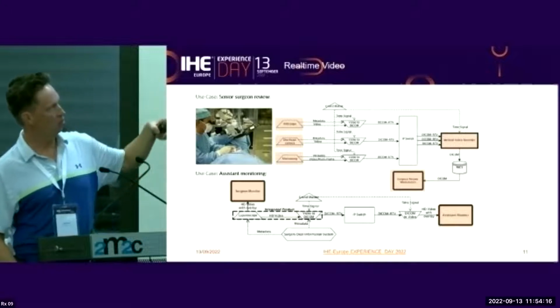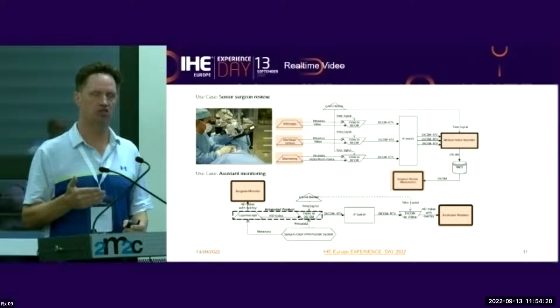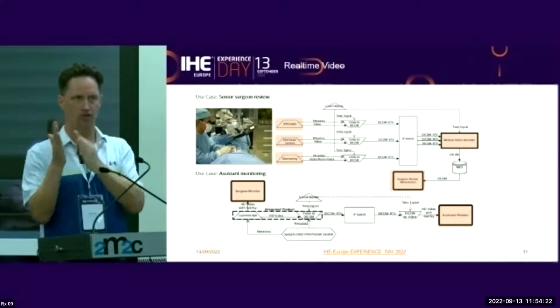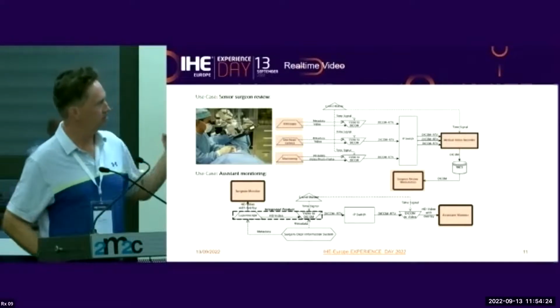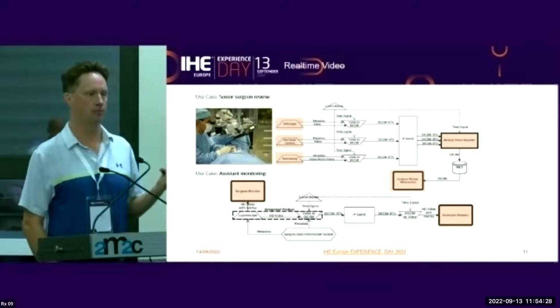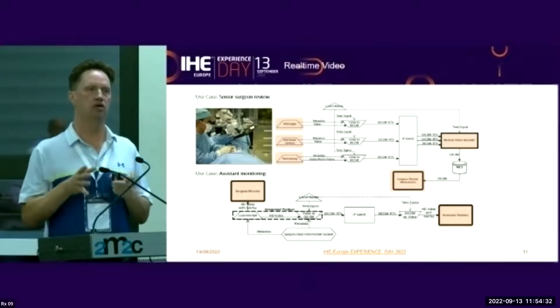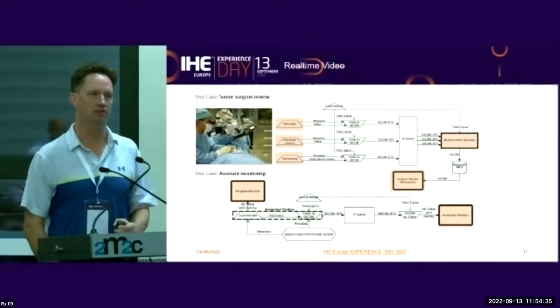And they are all exactly timed with a time source, so that they are in real time exactly aligned. And they are all going over an IP switch, in different channels, into a recording archive.